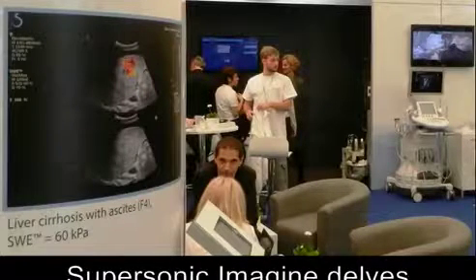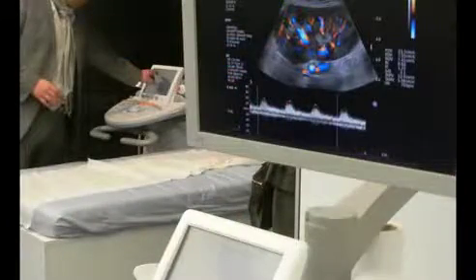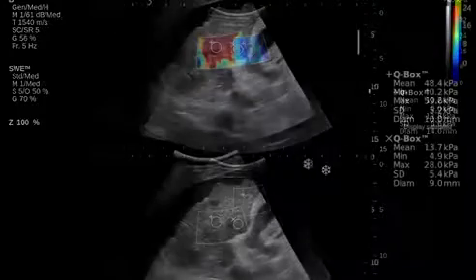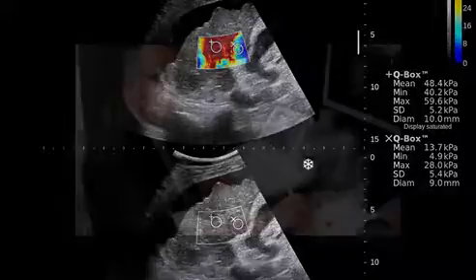Supersonic Imagine came to the ECR with an answer to the complex problem of liver disease. The French company's Explorer high-end ultrasound scanner can evaluate a wide range of disease indicators, but its ability to evaluate the liver stands out, particularly through its mix of B-mode and shear wave elastography, which quantifies the elasticity of liver tissue.